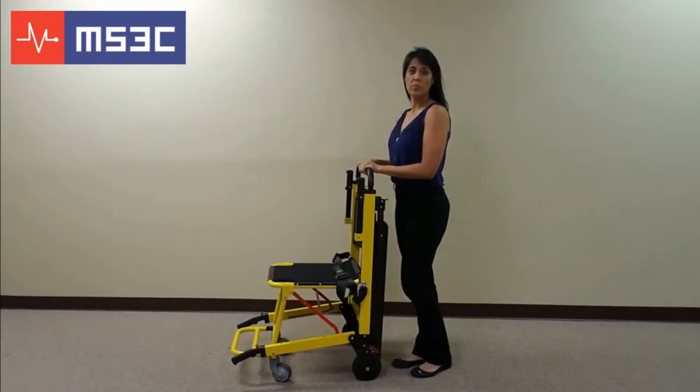Today we are going to walk you through the basic features and operations of the MS-3C-300TS, our manually operated evacuation stair chair. This chair's primary application is aiding individuals down a flight of stairs. Although this unit can be used by a single operator, we strongly advise using a second operator whenever available. Familiarize yourself with this unit prior to using it with a passenger. These next steps will show you the basic operations of the chair's features.